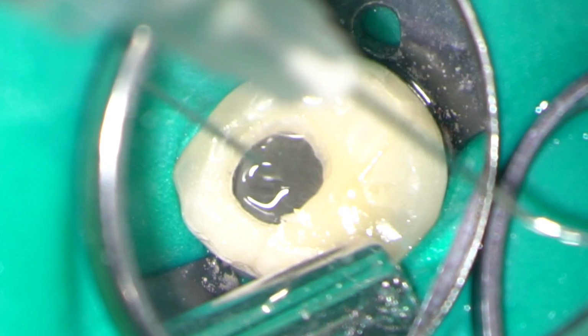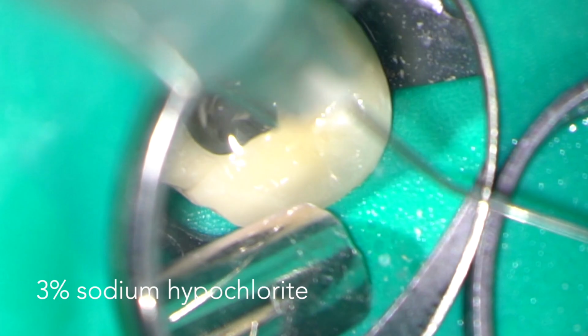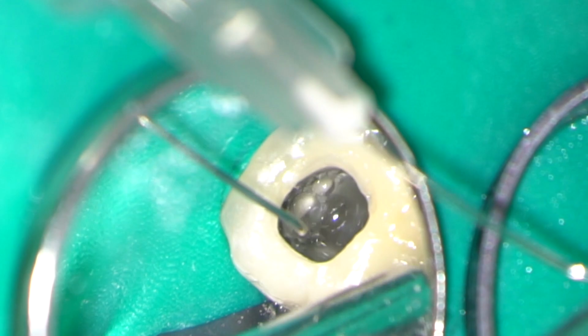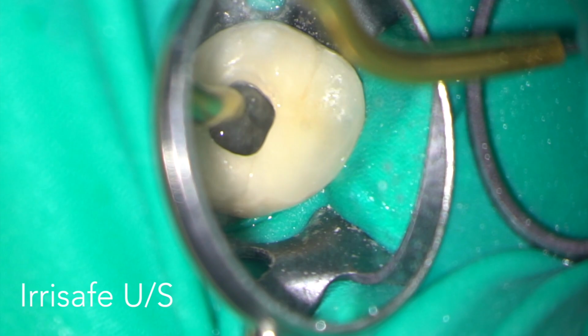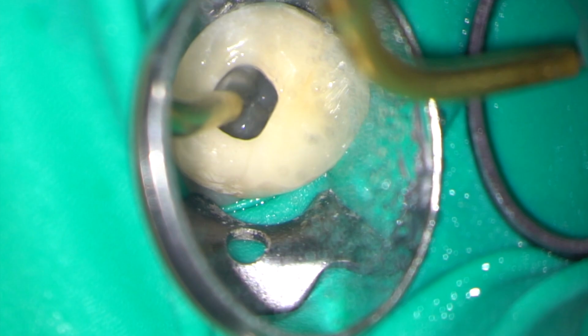The irrigation sequence consisted of 3% sodium hypochlorite agitated with an ultrasonic IrriSafe tip and 17% EDTA. After irrigation, all the canals were dried with sterile paper points and they were now ready for placement of a medicament, calcium hydroxide. There's a vlog coming up soon showing simple techniques for placement of calcium hydroxide.